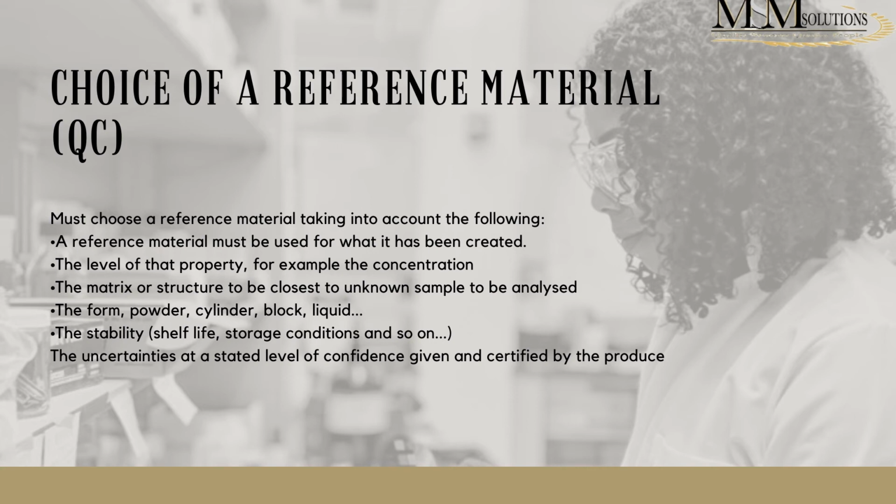Stability is also very important. This determines your shelf life, even storage conditions. You don't want to have a QC that's available today and it works and tomorrow it doesn't, because you also need consistency so that you're able to ensure that you have consistent results and produce consistent quality of your results. So if you have a very stable QC material that you can use over time, be it a week, a month, a year, or even longer, that is ideal.